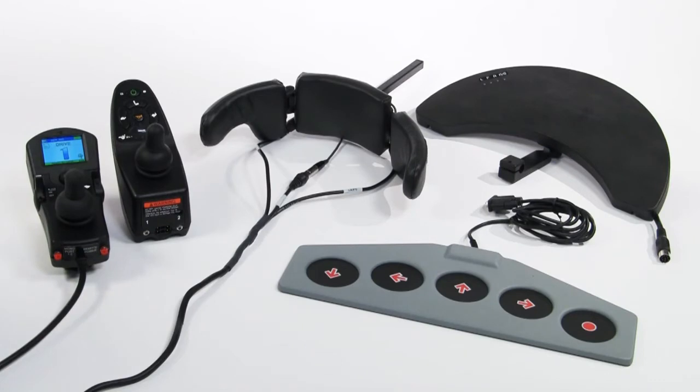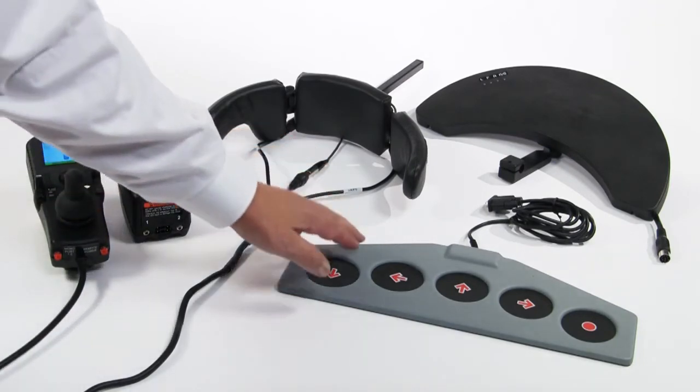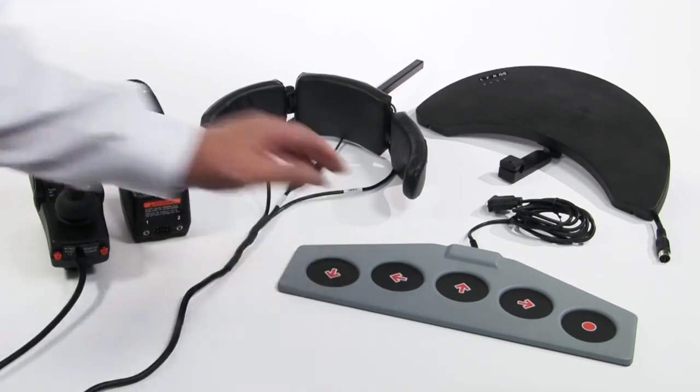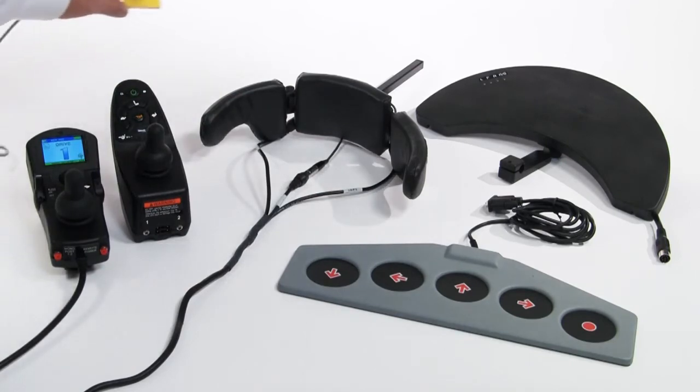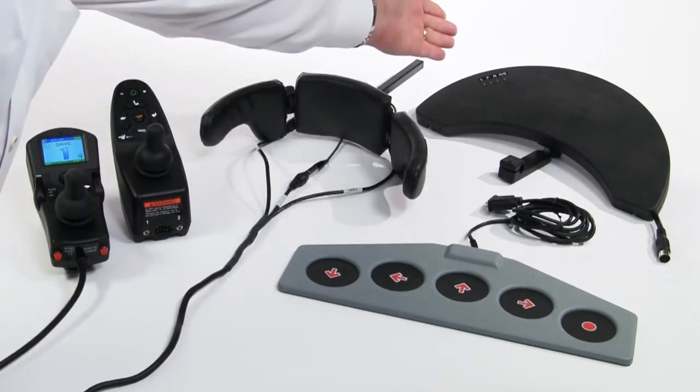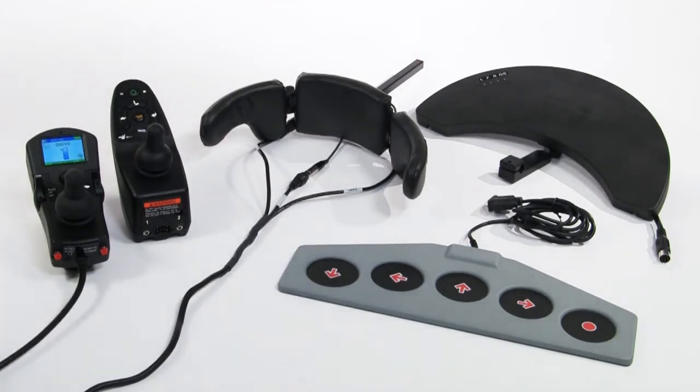The types of switches that can be incorporated into a digital driver control include both mechanical switches that require contact with the switch for activation, such as this wafer board, or electrical switches, such as this proximity switch in the wings of the head array, or fiber optic switches in this tray that require only getting close or covering the switch to activate it.